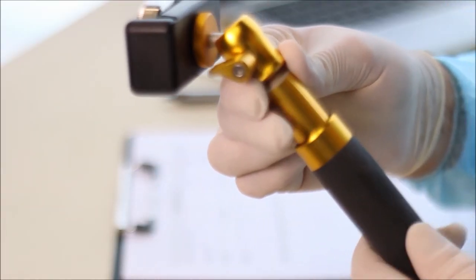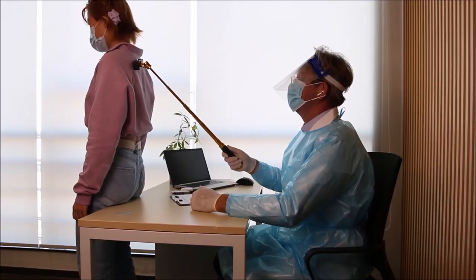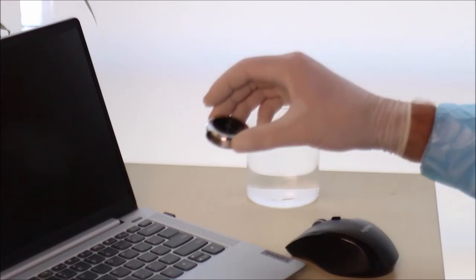You may use it with a selfie stick to auscultate from a safe distance, or you may just use it and disinfect it with an alcohol wipe.